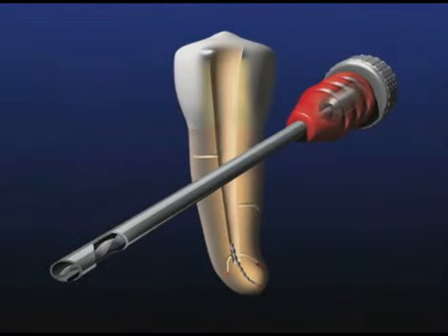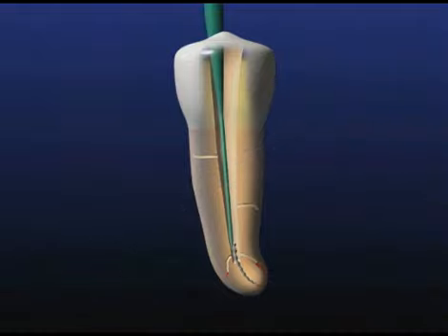Ultrasonics is the procedural choice when exposing and removing intercanal obstructions lodged deep within the root canal space. However, on occasion, ultrasonic trephining procedures are limited or prove ineffective. In these instances, the IRS may be utilized to mechanically engage and potentially remove the obstruction. Let's see how this device works.